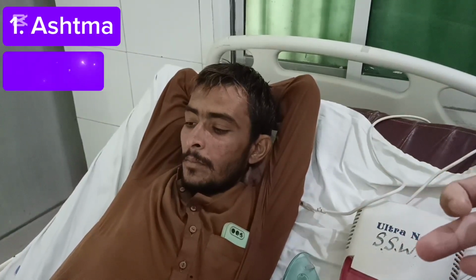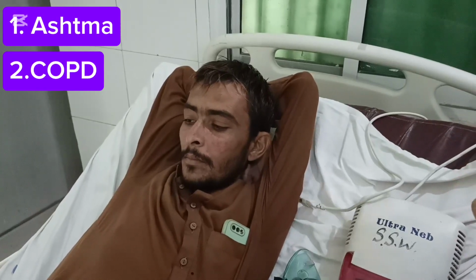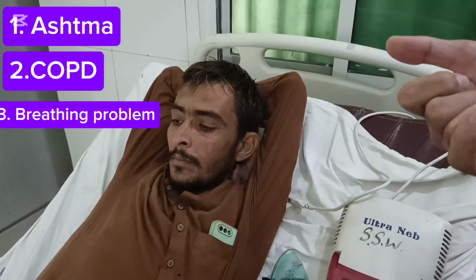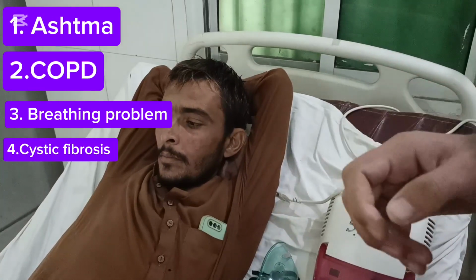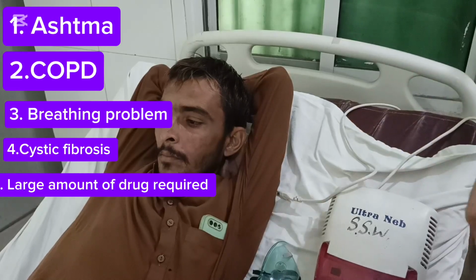And when the patient has COPD, chronic obstructive pulmonary disease, the patient should be nebulized. And when the patient has difficulty in breathing, the patient should be nebulized. And when the patient has cystic fibrosis, and when a large amount of medication is required directly in the lung, then the patient should be nebulized.